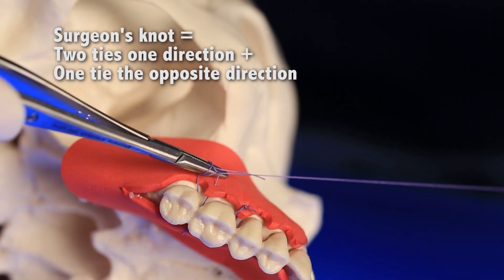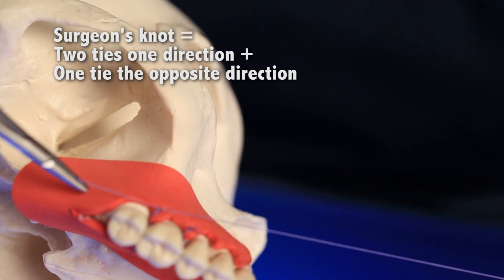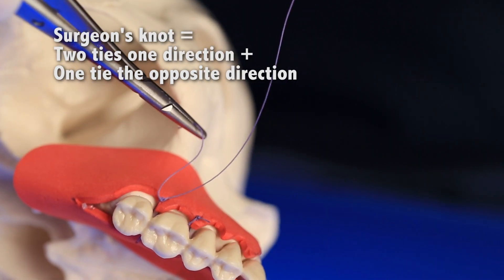You can add a few extra ties for security on slippery suture materials like polytetrafluoroethylenes, nylons, and polypropylenes. Alternatively, do two single ties in a row and snug the suture until the desired tightness, then lock it in with one to two ties in the opposite direction.